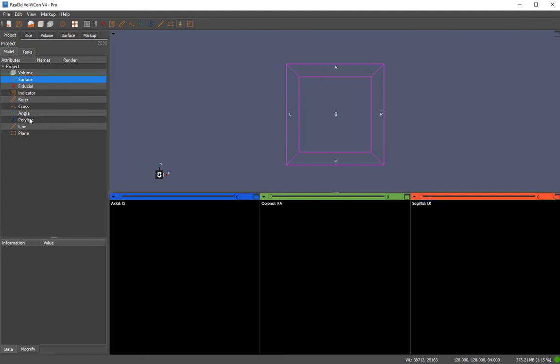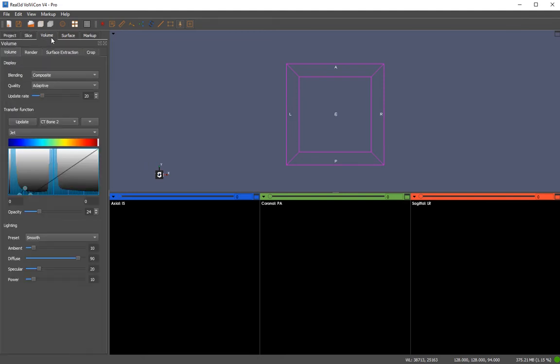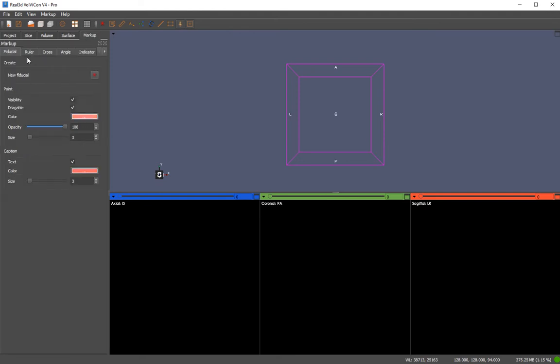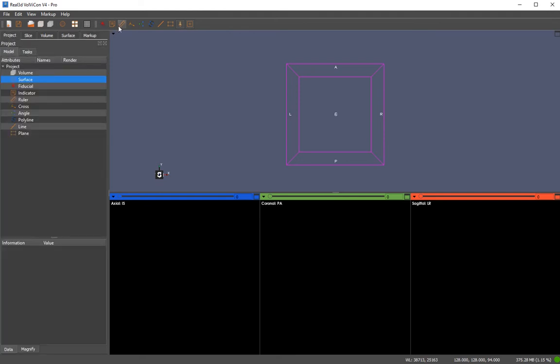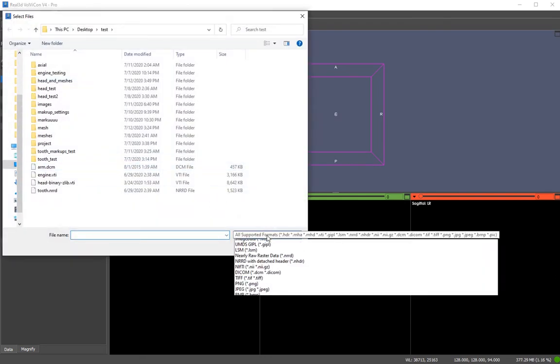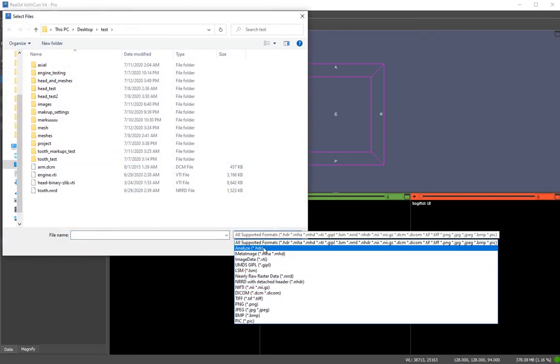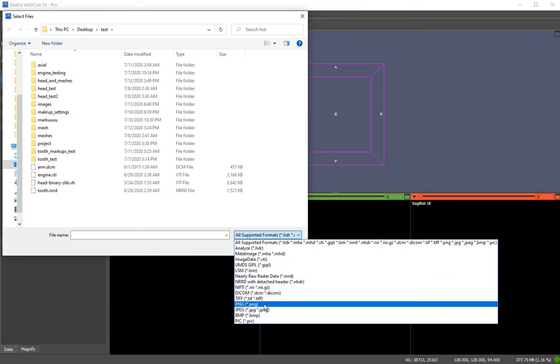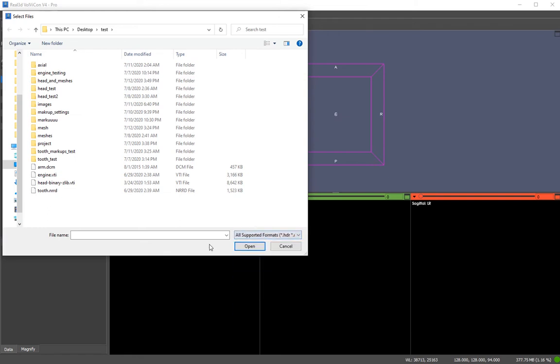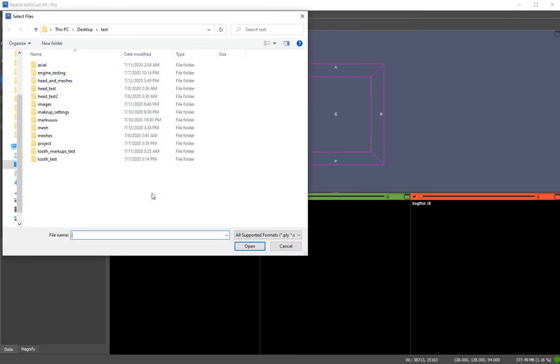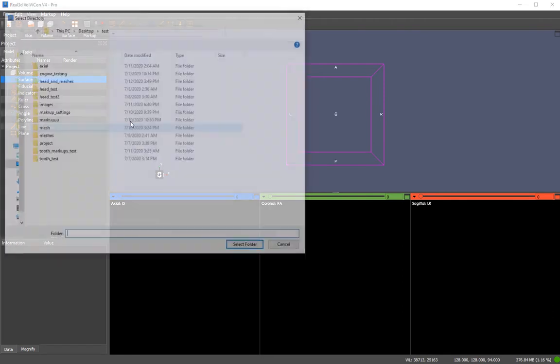You have a tree structure for each item: slice, volume, surface, and markup. Markup includes different measurement tools, and there is a shortcut for each markup. You can set the layout. Volvicon supports a number of well-known file formats — you can see what volume formats Volvicon can export. You can also import a single image as a volume for image analysis, and import mesh models.